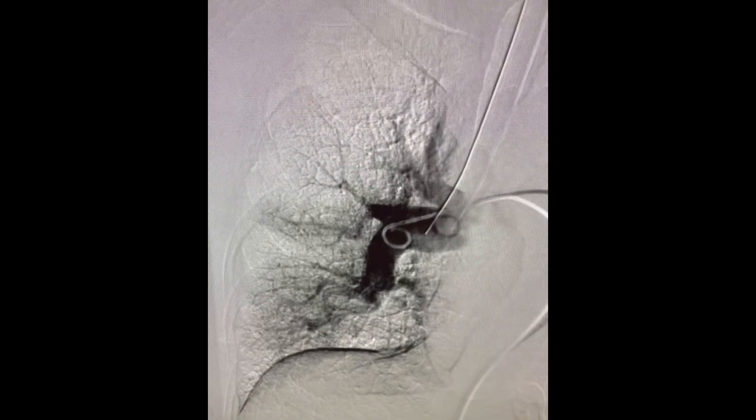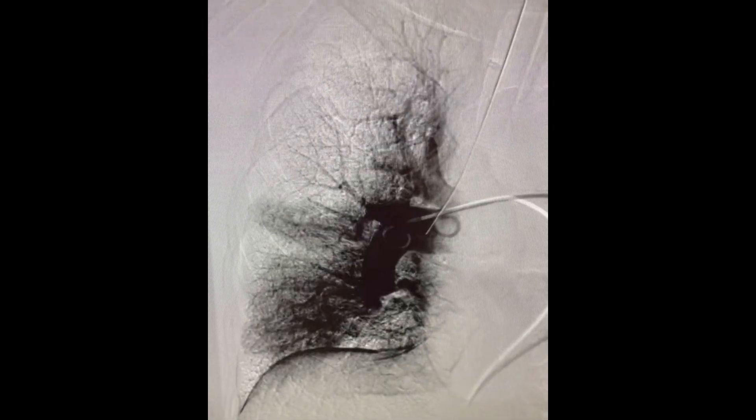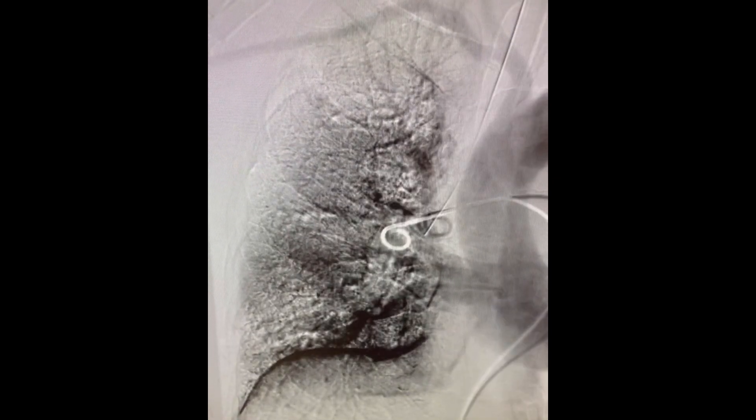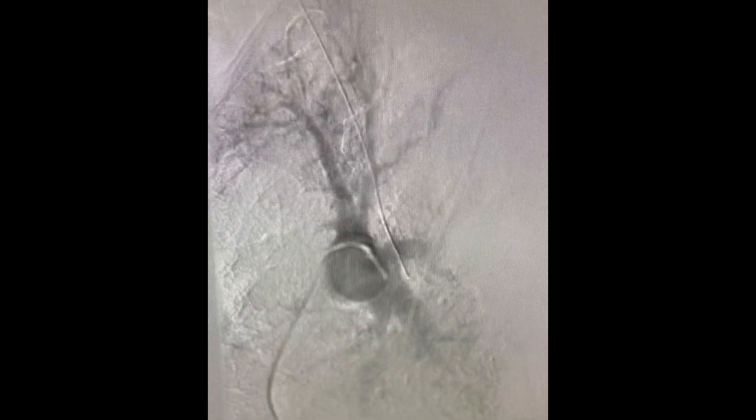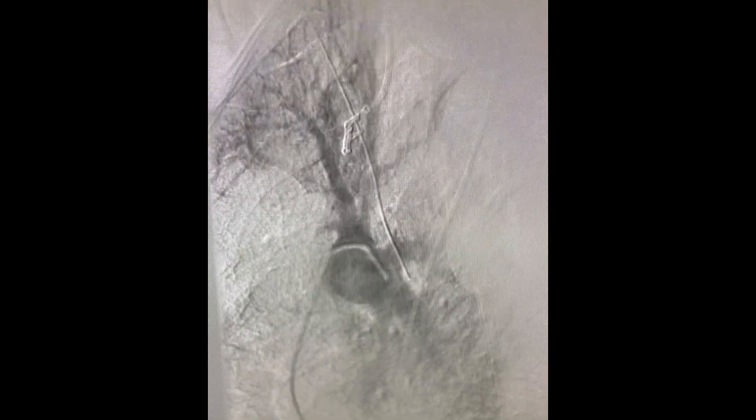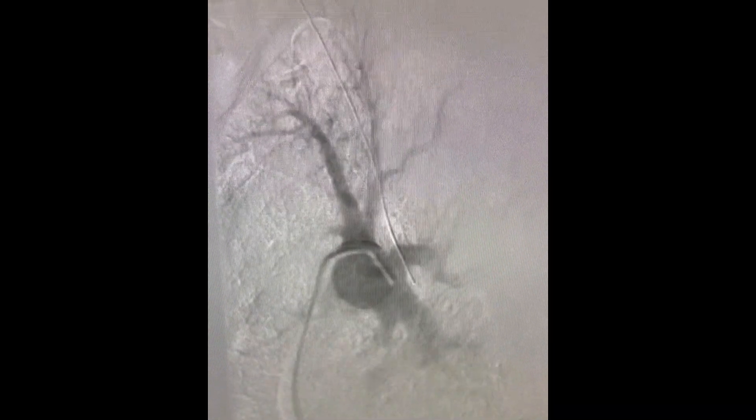You can notice here that the distal perfusion of the right and left lung is compromised. We always take angiograms in the AP and lateral projections to be able to separate the different branches.